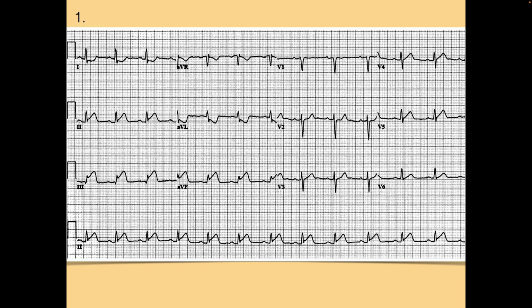Okay. So here is another one that is pretty much just inferior. Why don't you pass that down to Koa? And Koa, can you show us where the ST elevation is? 3. J point. I can't really find the J point. 2. I think it'd be right here. No, the J point, or right in here. Yeah, sorry.